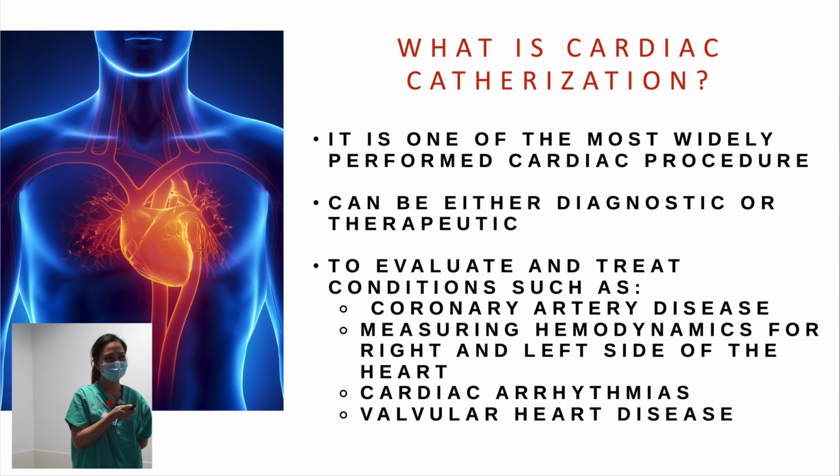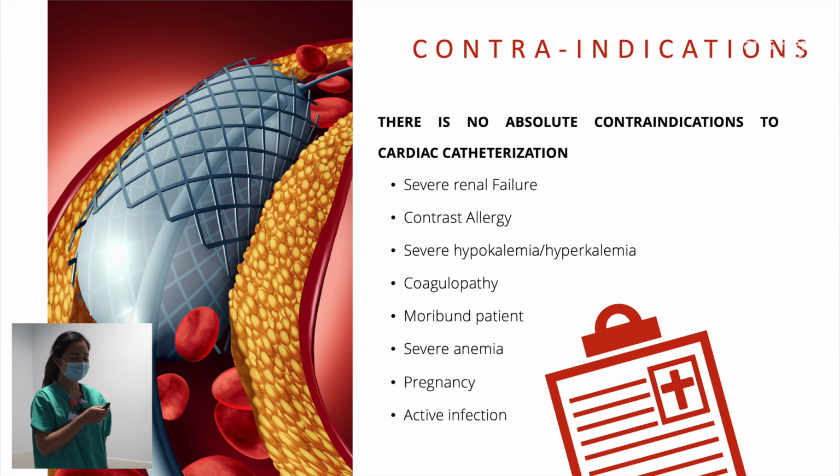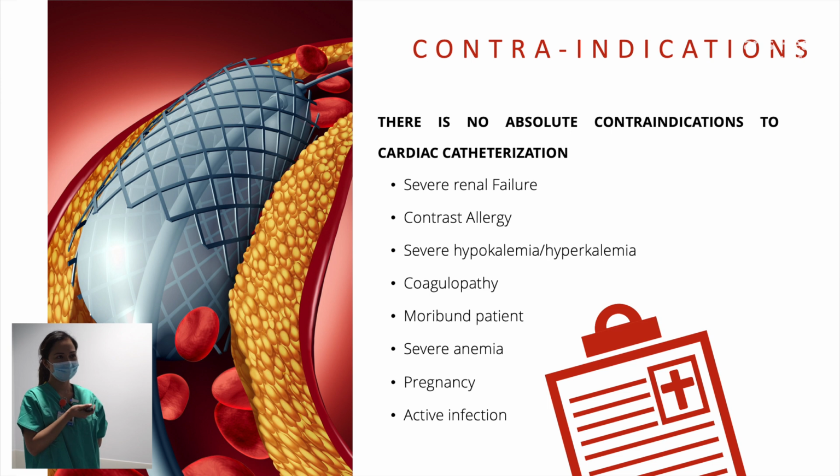So as for any procedure, there are contraindications, but take note that there are no absolute contraindications for cardiac caths, mainly because the benefits outweigh the risks, and we usually manage them before bringing the patient for the procedure. For example, severe renal failure. This is part of our checklists. It's very important to check the patient's renal function because our procedures mainly use contrast medium. So as part of our checklist, we check the CIN protocol.